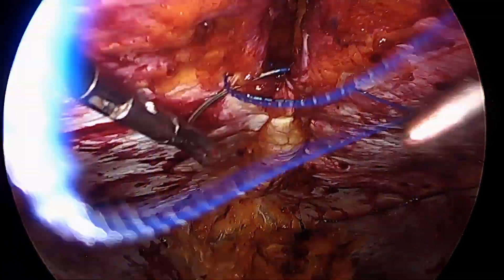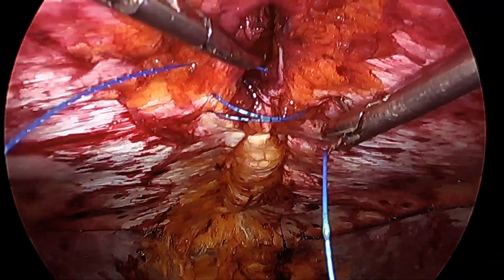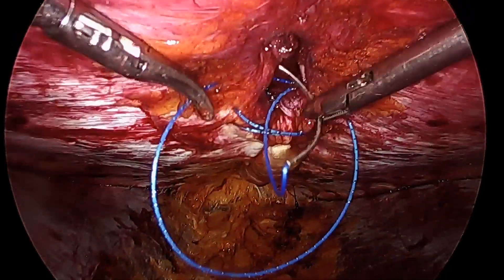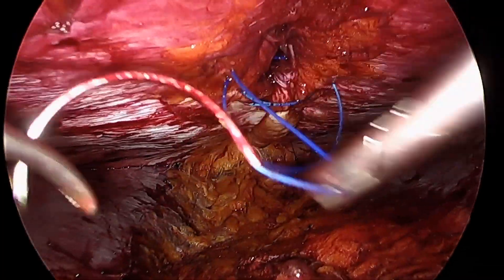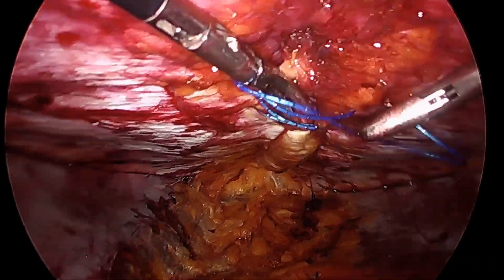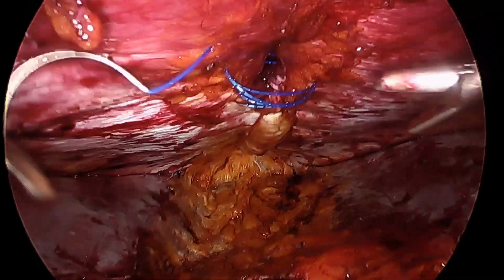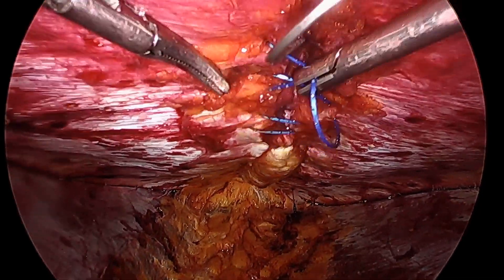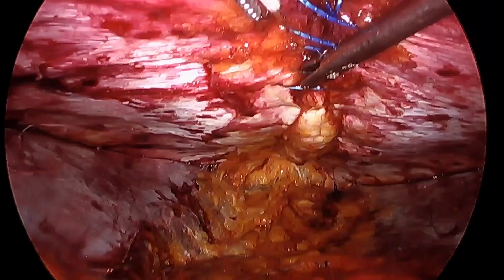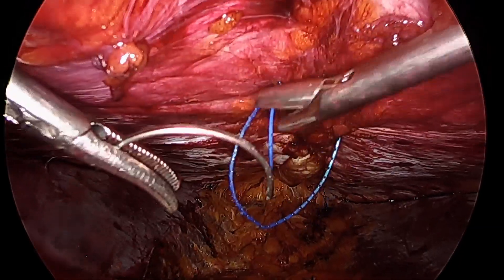When I have the defect like this, I prefer not to run the suture to shut it closed. I prefer to keep the defect open so I can throw stitches close to each other and make sure that there's enough suture for the length of defect I want to close, trying to preserve the 4-to-1 ratio recommended by the experts. I usually run the suture a little further from the defect, then secure it tightly. I do this a couple of times so the tension along the defect is well distributed and the suture is less likely to break or become injured by my manipulation.